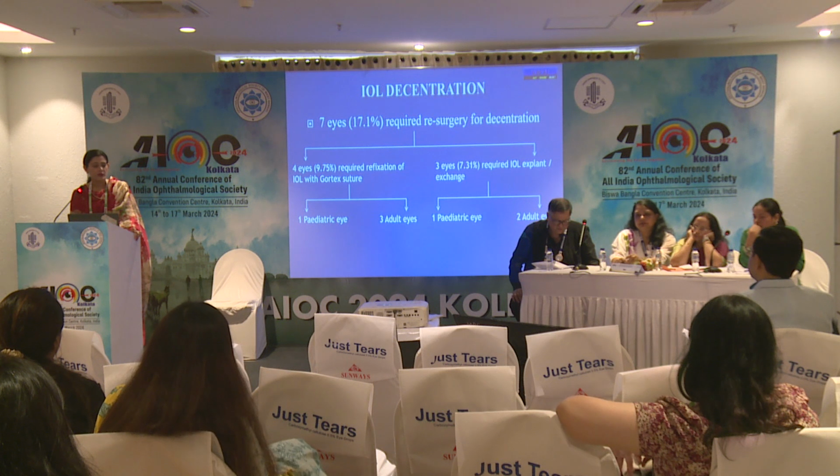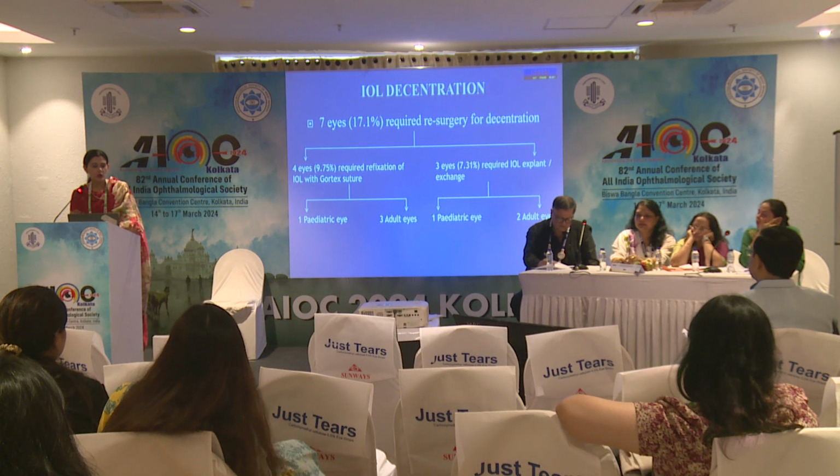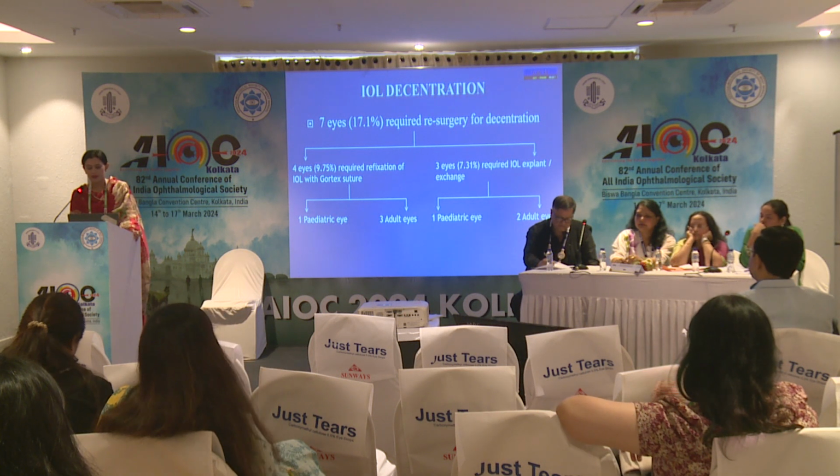In 4, we could refixate the original IOL bag complex using Gore-Tex, and in 3 eyes, we had to explant and have a secondary IOL. It is not just pediatric eyes, but also adult eyes that undergo decentration. Therefore, all these patients need very good preoperative counseling for the secondary surgery.